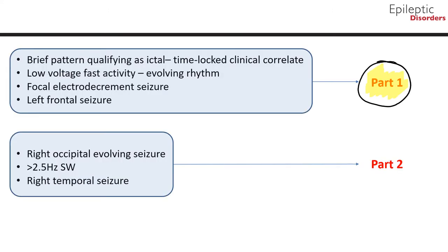In part 1 of this module, we will discuss the following seizures: a brief pattern qualifying as ictal with a time-locked clinical correlate, a pattern of low-voltage fast activity and evolving rhythm, a focal electrodecrement seizure, and a left frontal seizure. In part 2, we will discuss a right occipital evolving seizure, a seizure consisting of greater than 2.5 Hz spike wave pattern, and a right temporal seizure.